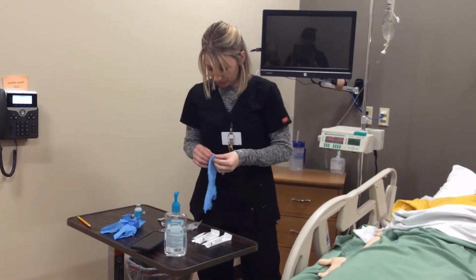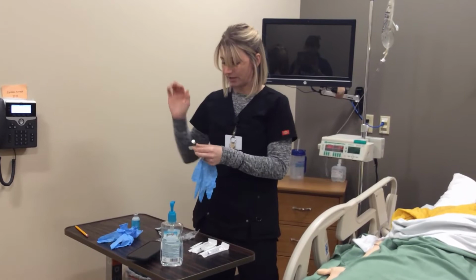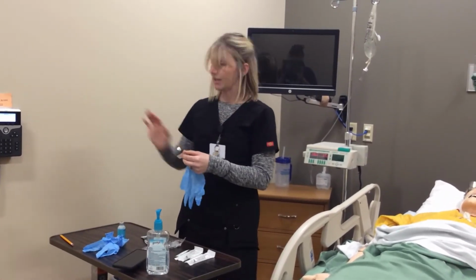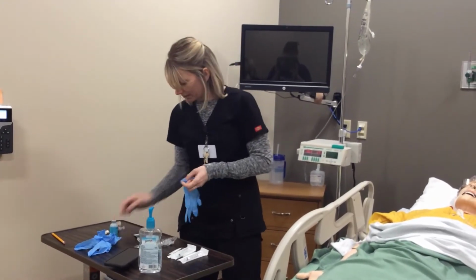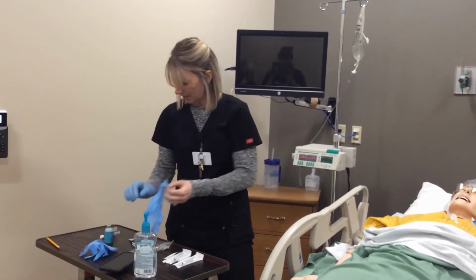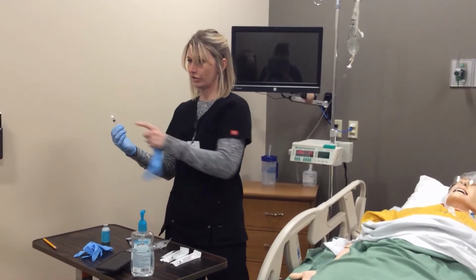So what I'm going to do, I've got my MAR up. I take a look. Again, I verify my name, date of birth to my patient. I've already checked his armband. Looking at the allergies, he is not allergic to morphine. I'm going to go ahead and scroll down. I find the morphine on my list. And I'm going to say, okay, I've got morphine 2 milligrams. My orders for morphine 2 milligrams.